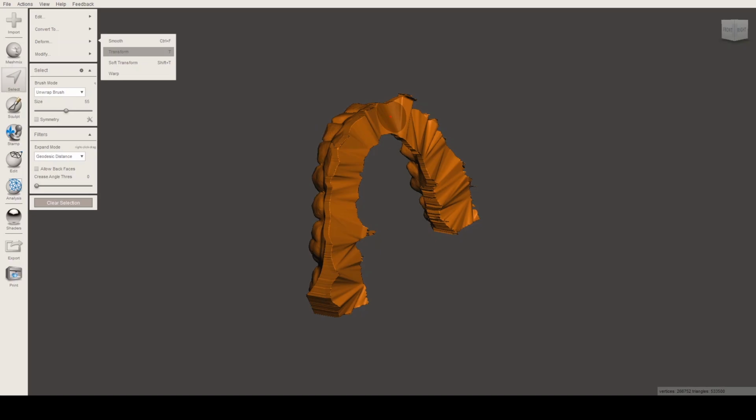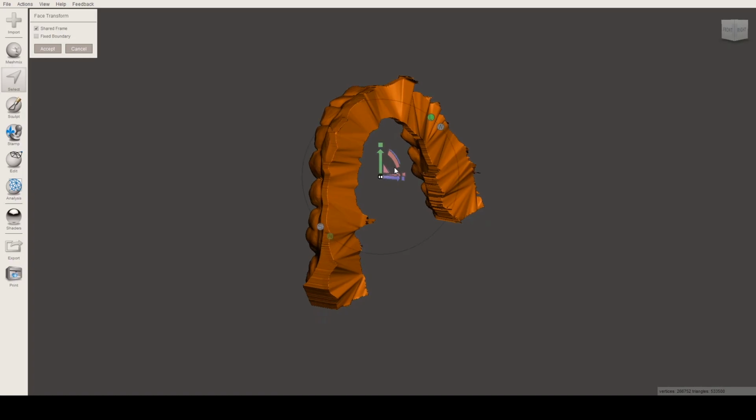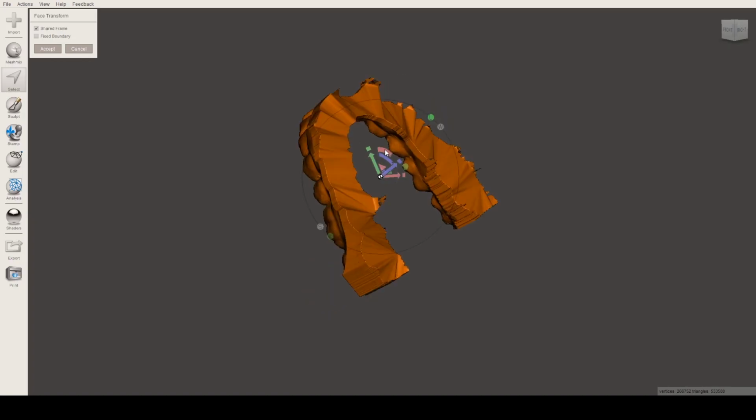By the way, again, you might want to be patient with your Meshmixer software, especially if your laptops or your computers are not that powerful. Now, here we have the axis of where you want to move it or transform it. You can just drag it. Oh, it's still slow. I'm sorry, guys. Or you can rotate it the way you want. So here we are rotating.